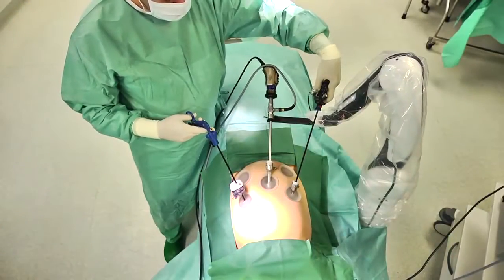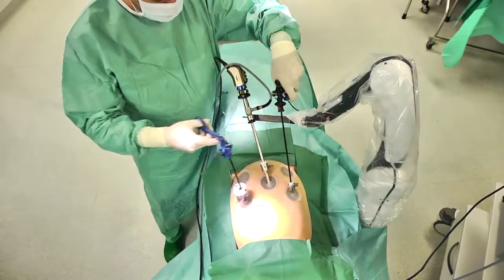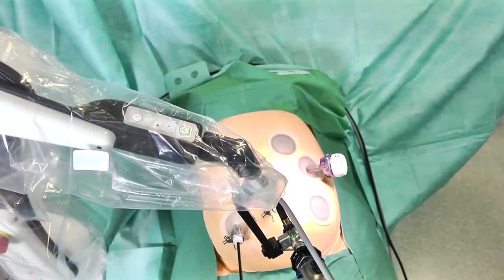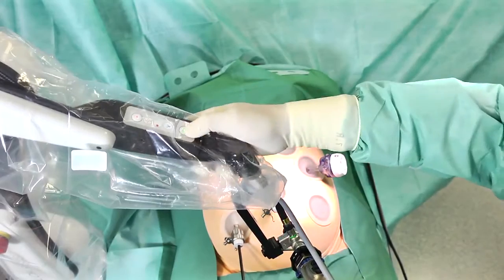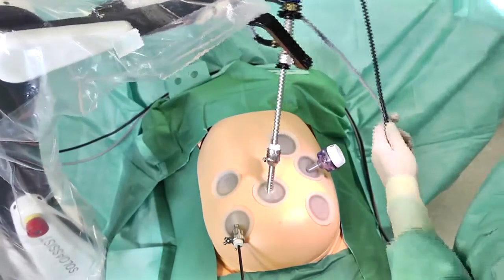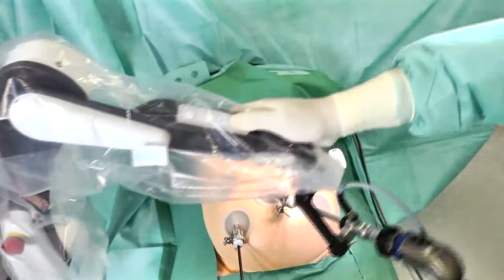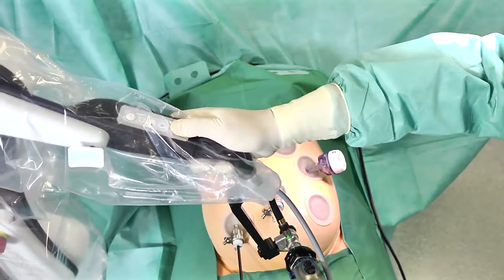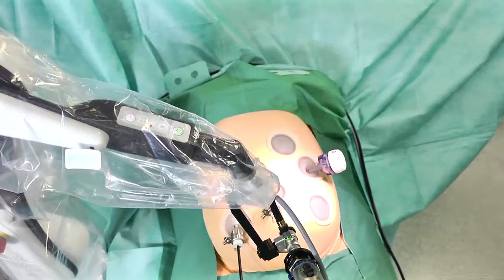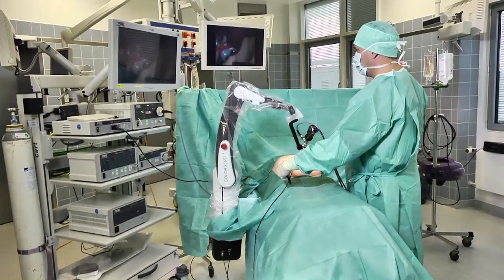The trocar point always remains steady, thus avoiding collision with the surgical instruments. These settings can also be used safely and easily for single port interventions. If required, the Solo Assist obeys you at the push of a release button, meaning you can adjust the arm manually at any time. It will automatically remain in its new position, and the trocar point also stays the same.